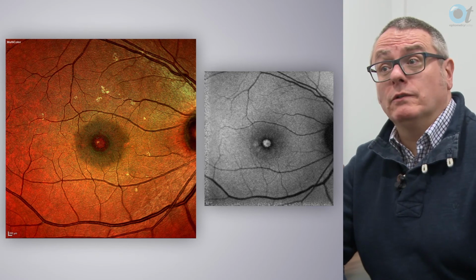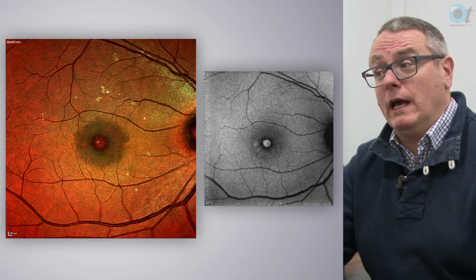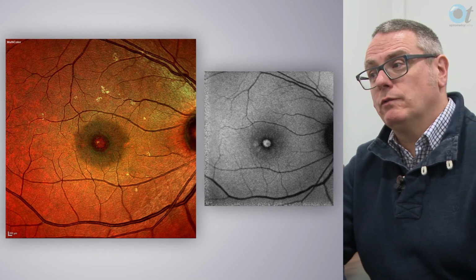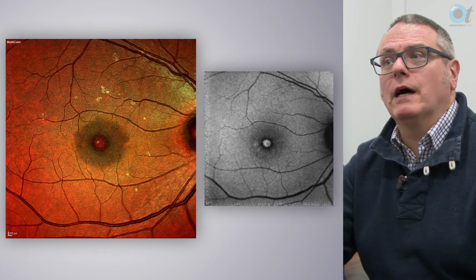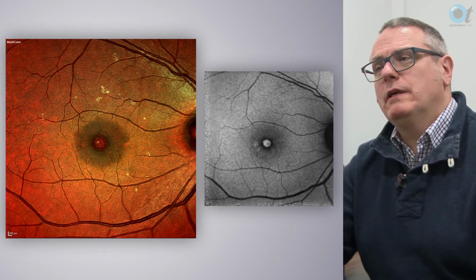The patient needs to be referred on to hospital eye services for possible surgical intervention. In terms of urgency of the referral, that will largely need to be guided by your local referral policies. We need to be thinking about the fellow eye.